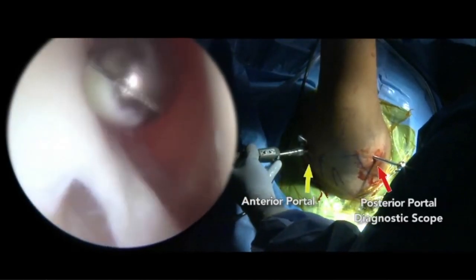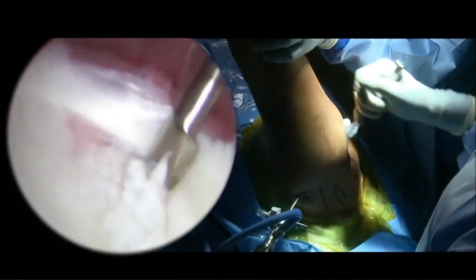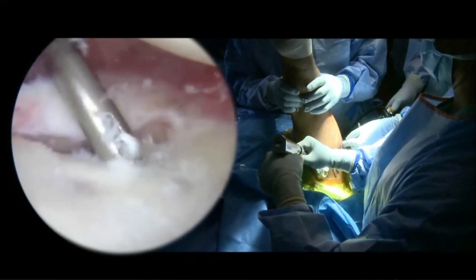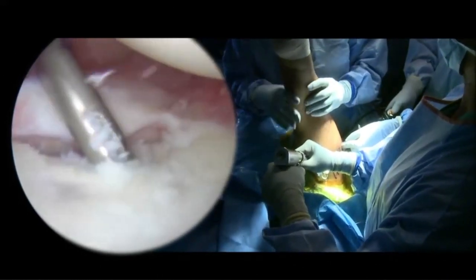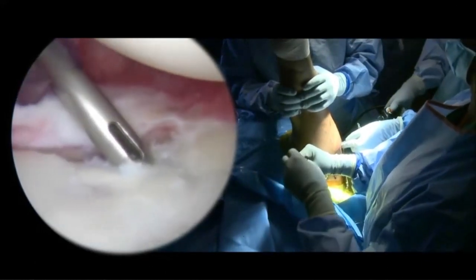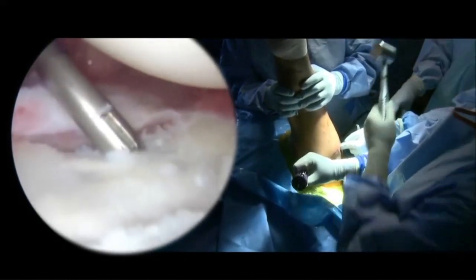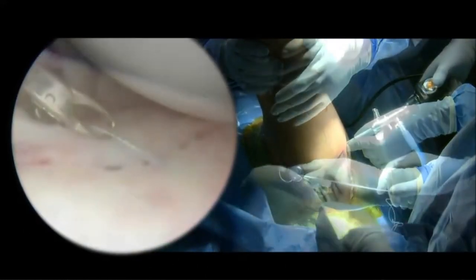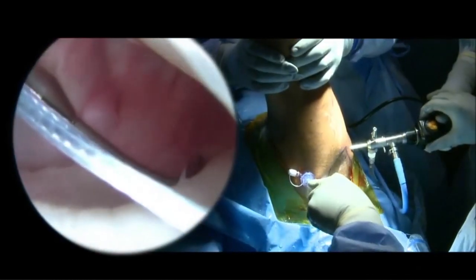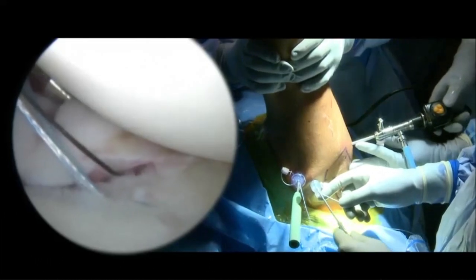Here you can see the setup in lateral decubitus position. We start with the scope posteriorly and then create our anterior superior portal. You can see the pan-labral tear associated with this patient with multi-directional instability. We elevate the labrum. Since the principal direction is anterior, we start anteriorly first to get a nice shift. We've placed one knotless suture tack anchor through a guide inferiorly at approximately the 5 o'clock position, and now we're working superiorly to approximately the 3:30 position. You can see the anchor going through the guide after drilling with a hard bone drill, which we typically use in young patients with good quality bone. We retrieve the suture out the anterior superior cannula and use the 25-degree tight curve lasso to pass the suture, performing a capsulolabral shift.